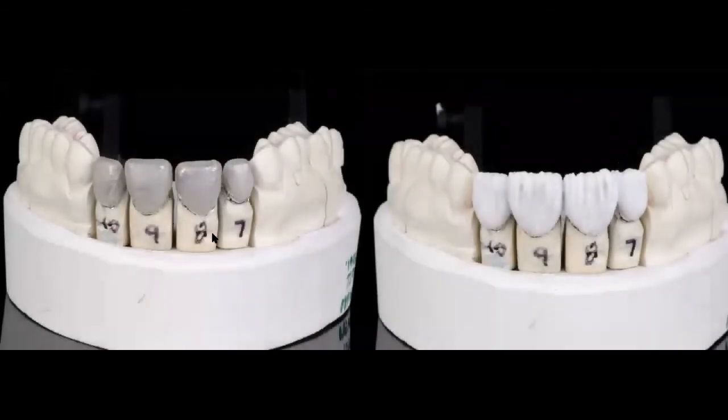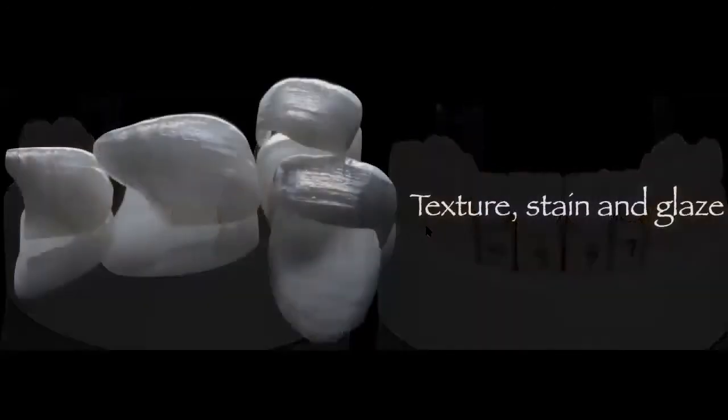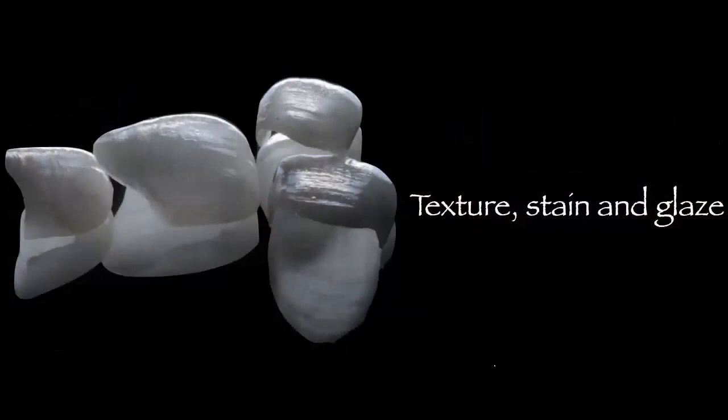They use different layers of the ceramic, and all these layers are enamel, dentin. They use white, gray, orange, yellow, all these different shades that they go into, and then they have to either use a special type of stone, or they use this type of technique where they use this foil paper and they literally bake the ceramic on top of that foil paper.